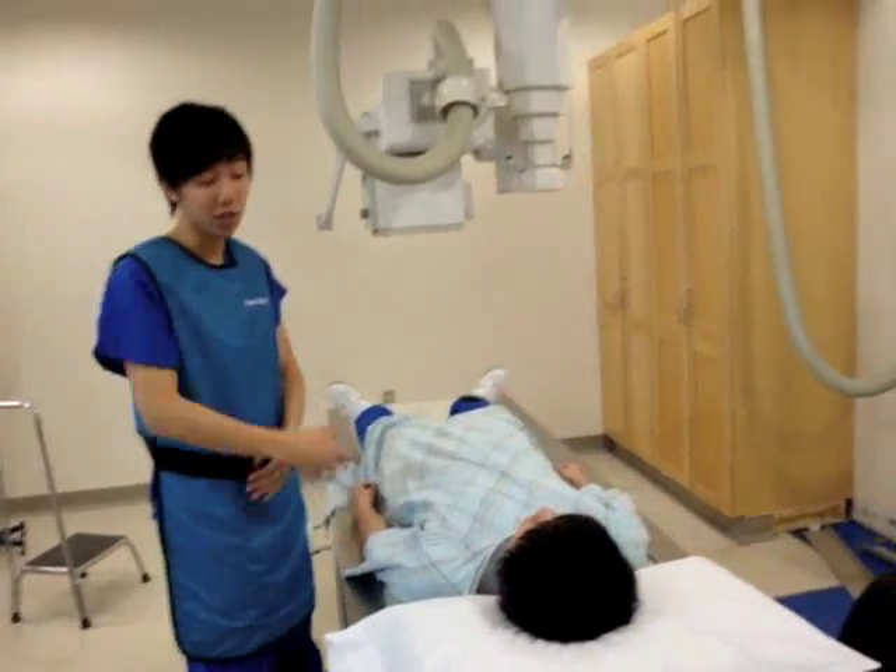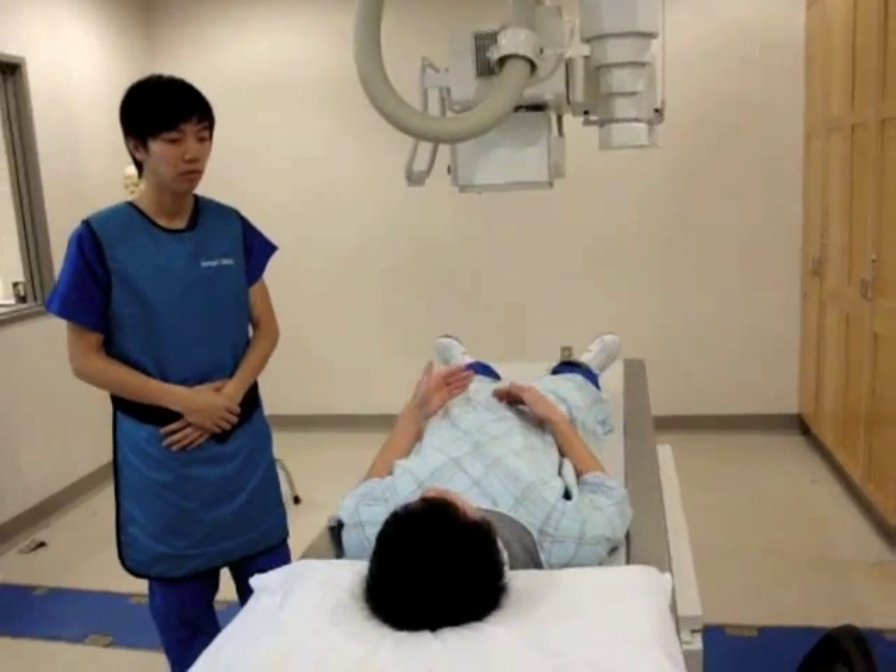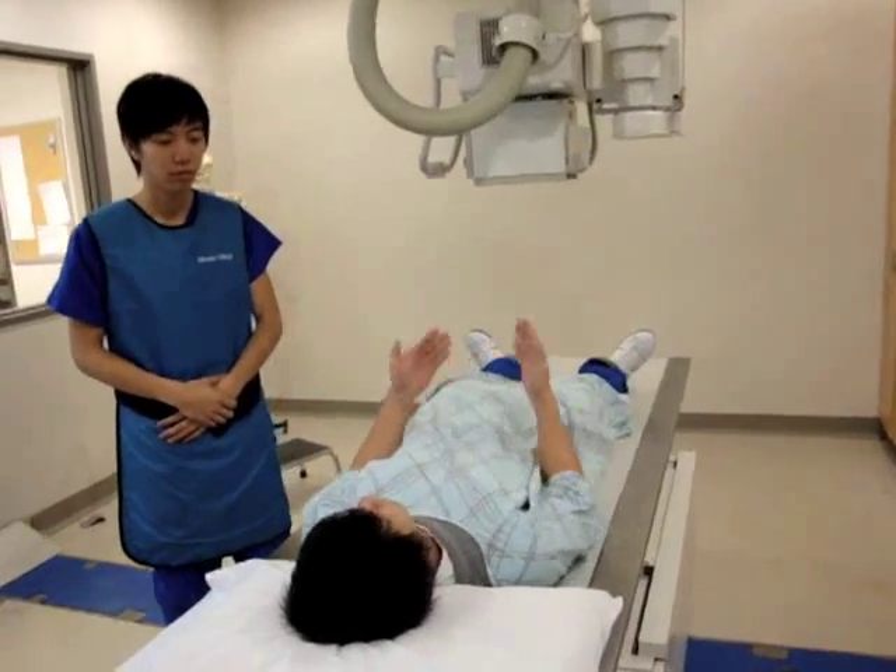Do you actually have any questions before we can begin? Yes, I just have one question. During the procedure, how am I being protected from the radiation?